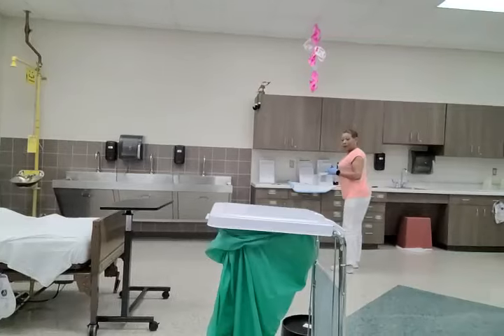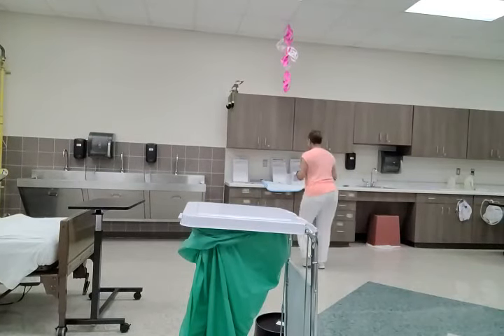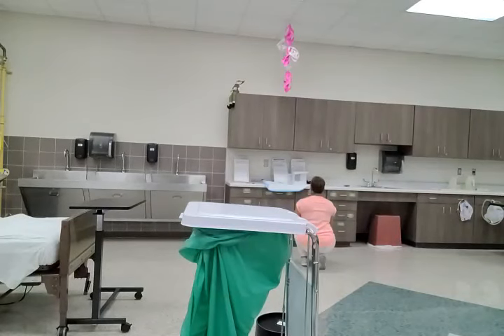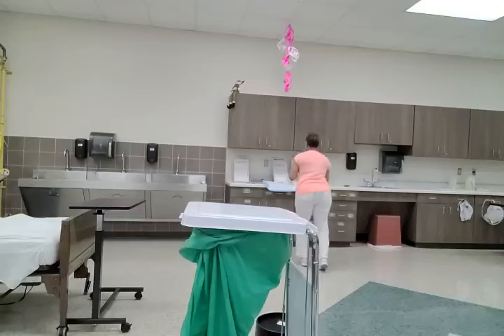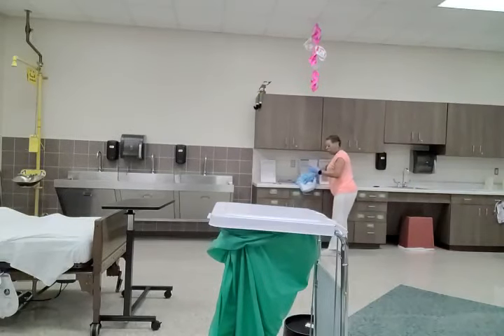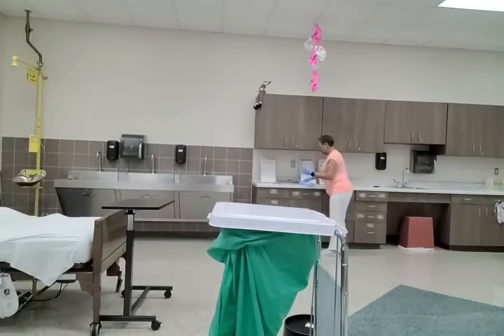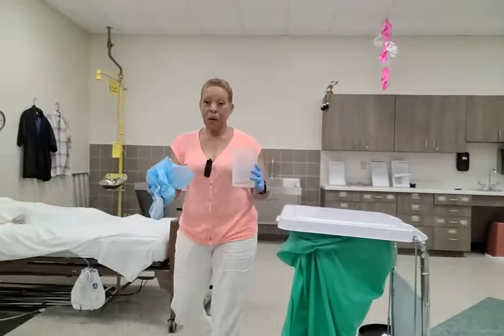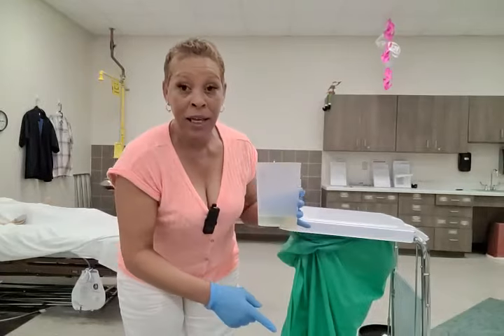Now I'm going to get down at eye level by squatting and I'm going to measure the urinary output. Once I've measured the urinary output, I'm going to roll up my clean barrier.